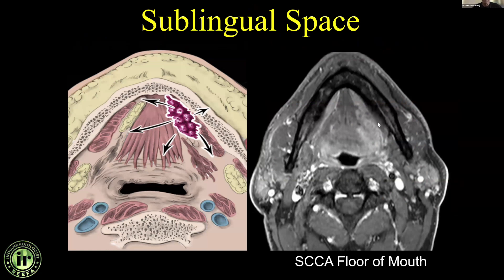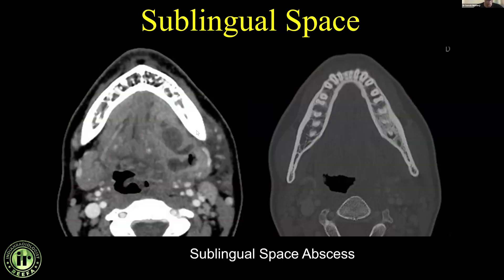This is a classic example of an aggressive mass involving the floor of the mouth. It's non-specific — this could be squamous cell carcinoma or a minor salivary gland tumor — but because squamous cell carcinomas comprise about 95% of tumors, that's where I'd put my money. Here's an example of a floor of mouth abscess, a sublingual space abscess, medial to the mylohyoid muscle.